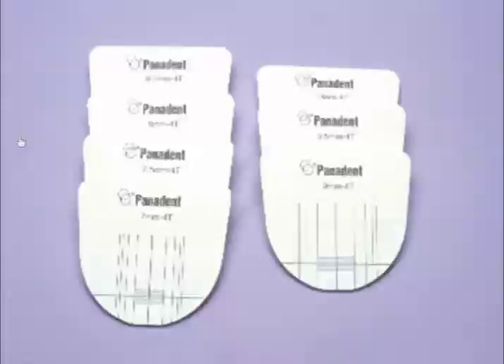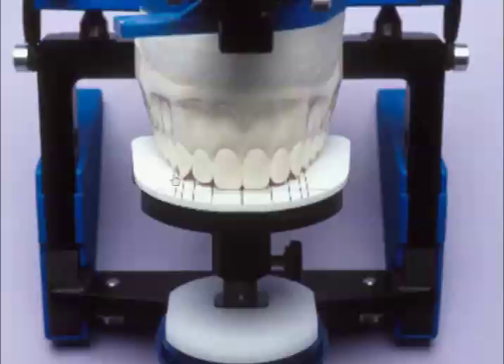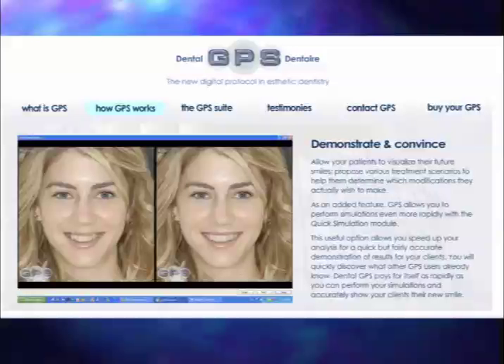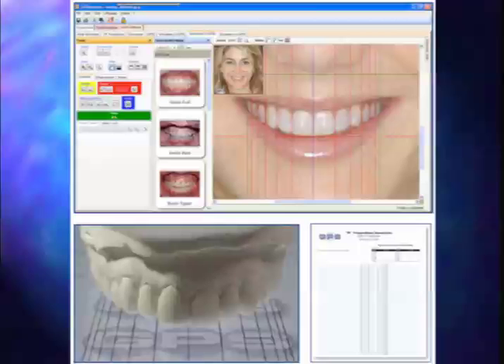Well, we did develop golden proportion waxing guides that can be added to the COIS platform to help evaluate tooth widths, the width of the central to the apparent width of the lateral to the cusp tip of the canine. And if you don't like golden proportion, I recommend visiting Dental GPS, where Dr. Elaine Mathod has developed a computer software program where you can import the patient's face and actually set up different proportions of the teeth and evaluate that to come up with a patient-specific proportion tooth guide.